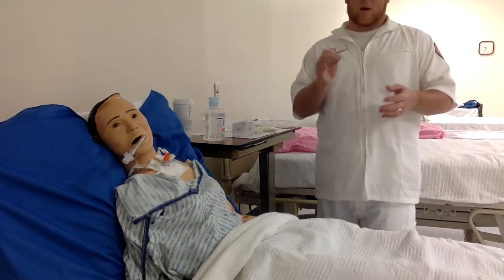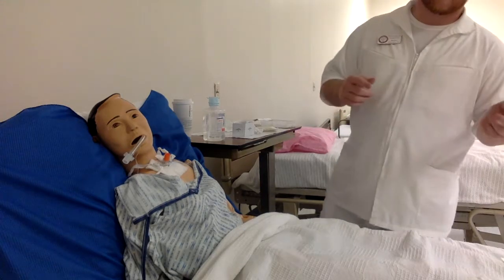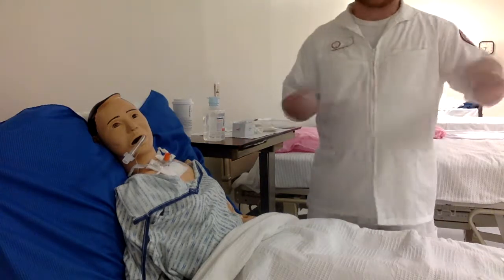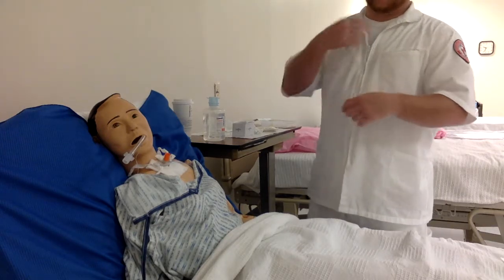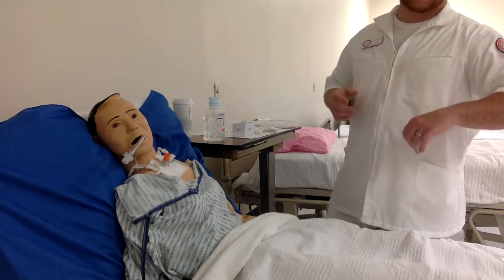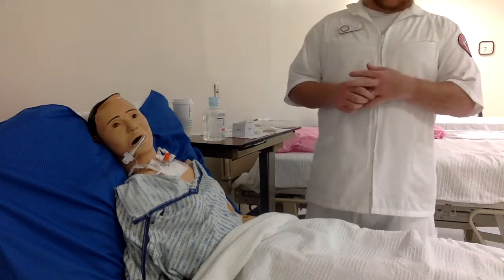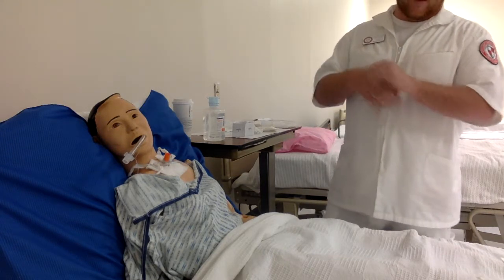Another really important point: make sure there is an unused sterile tracheostomy suction kit left in the room when you leave. If the patient becomes distressed, instead of running down the hall to find supplies, it's already there. If the airway becomes occluded with a mucus plug, having that kit immediately available can save critical minutes of breathing time. Always keep a kit in the room and document all your findings. That is all for tracheostomy suctioning — thank you so much for watching.